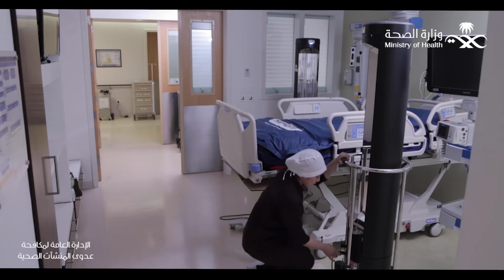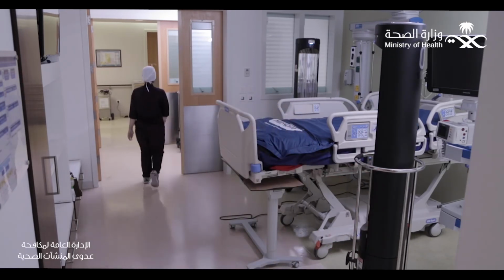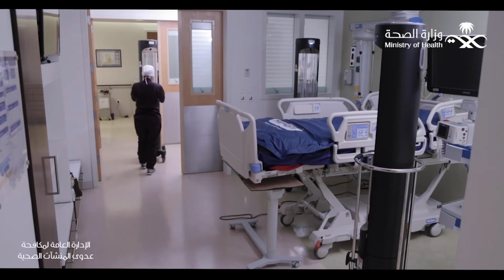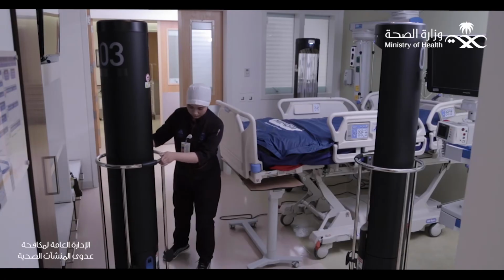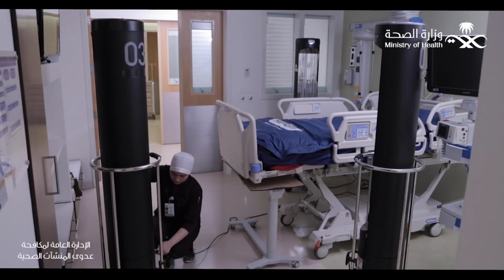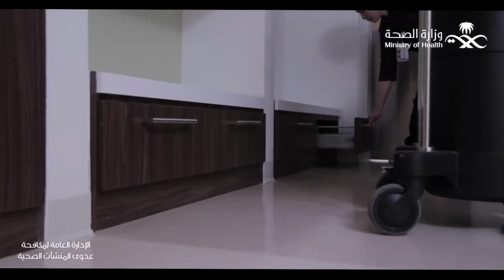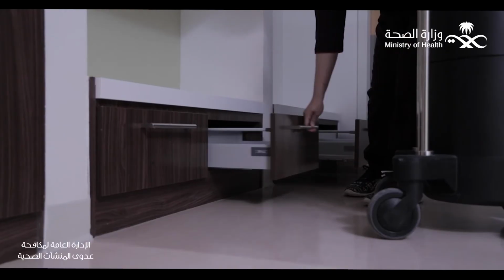The health worker enters the room, connects and arranges its position inside the room so that the ultraviolet rays are exposed to all environmental surfaces from all directions in the room. Remove all covers so that everything is exposed to ultraviolet rays and thus can be disinfected, followed by opening all drawers, cabinets and all hidden places inside the room to be disinfected.